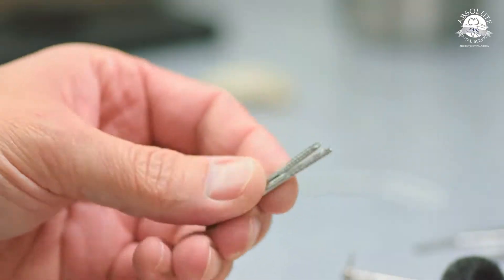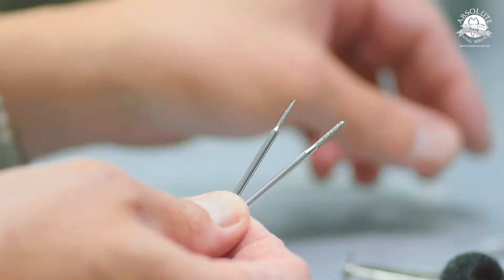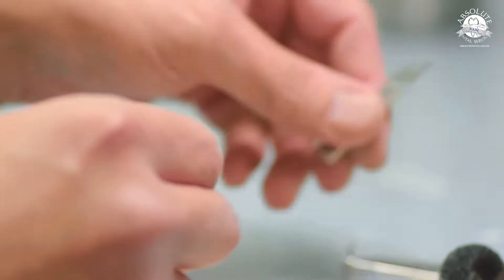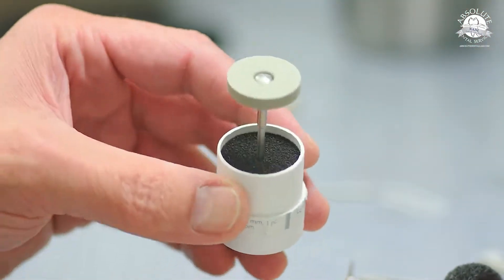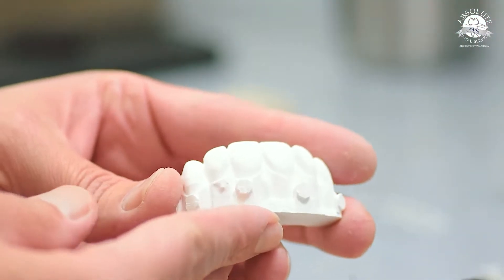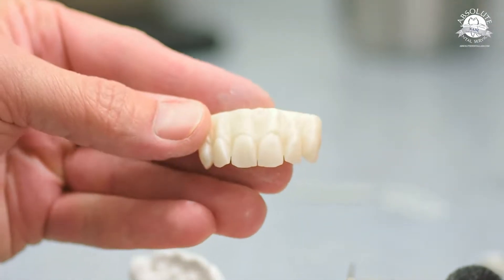These are going to be the two carbides I use — I'll put the item numbers up for all of these at the end of the video. H42R: a flame and a taper. This is HP Dent Yellowstone — this will do a great job if you do have to adjust post-sinter. You don't want to create any heat, and this will reduce without creating heat. This is a six-unit case I use quite often for courses and lecturing. We're going to green stage finish it to get a great result.